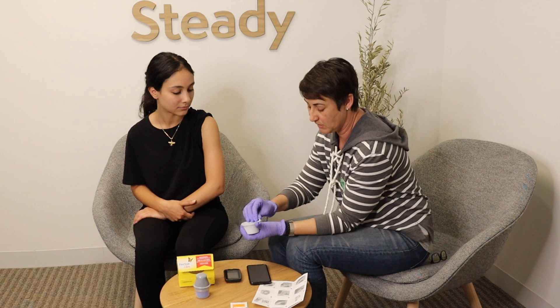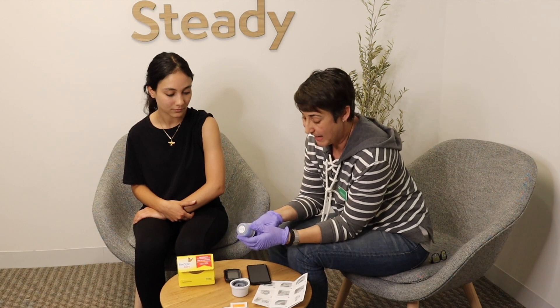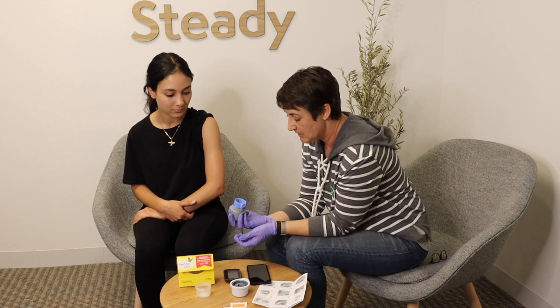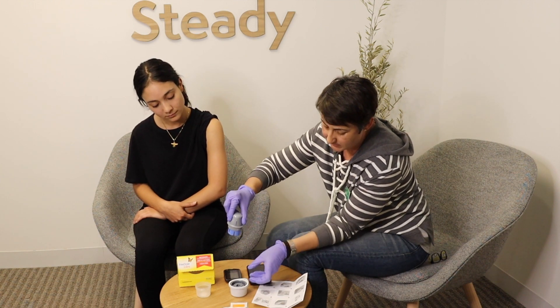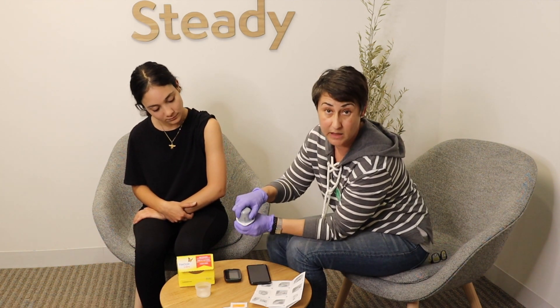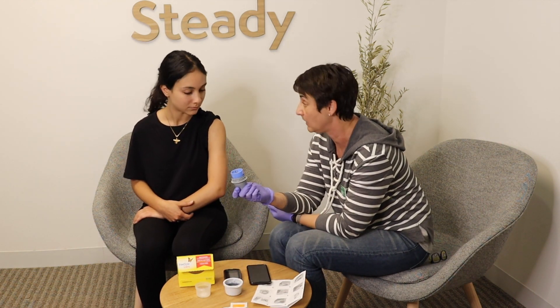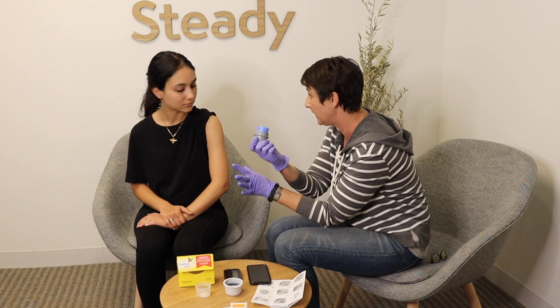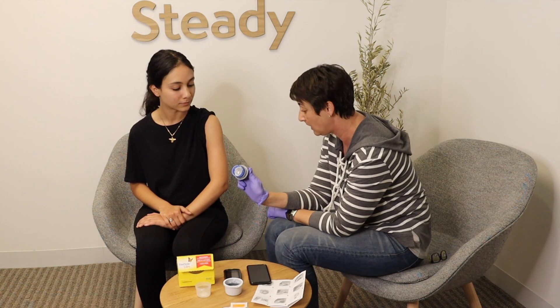We're okay with this one, so I'm going to peel the top off — this is the applicator. We're going to twist and crack it, and save the cap piece. The sensor is actually going to go together with the applicator. There are two lines on the applicator and the sensor base that line up, and you just pop it down into place. The two pieces are connected and you pull it out — it's all in here now and activated, ready to go. I'm literally just going to push this onto your skin — you'll hear a small little click. I'll hold it there for a couple of seconds to make sure it adheres to your skin well, and then pull it off.